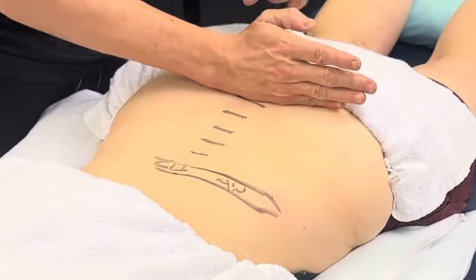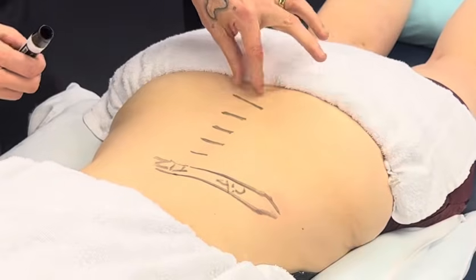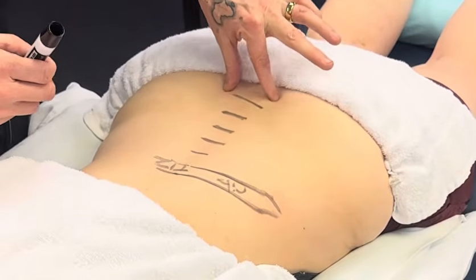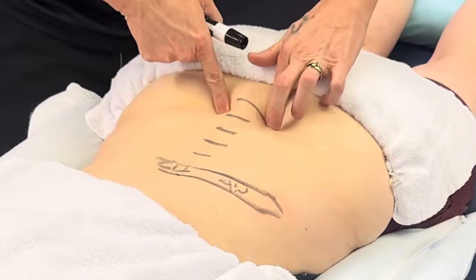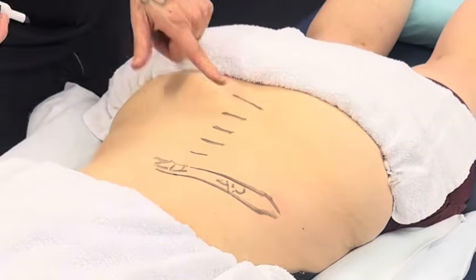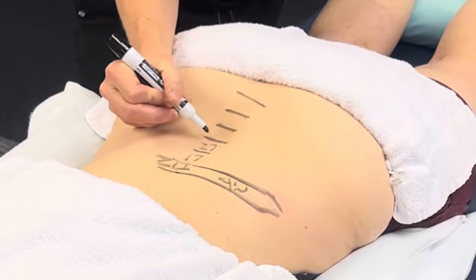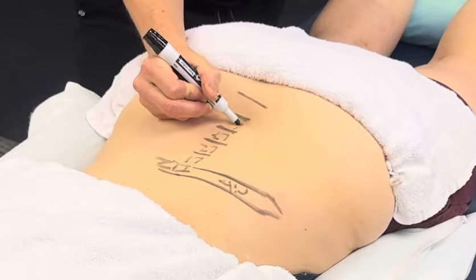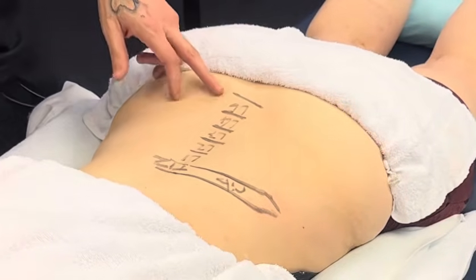You can spring it, okay? Or what you can do is you can come just lateral to that and say, oh no, there's sacrum there, you know what I'm saying? So, there we go. L1, L2, L3, L4, L5. These are the spinous processes, okay?